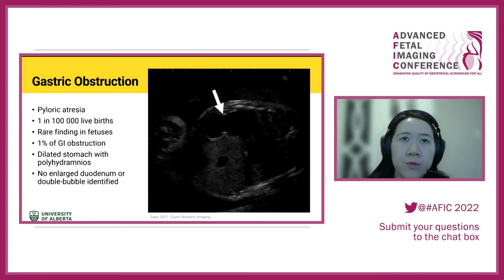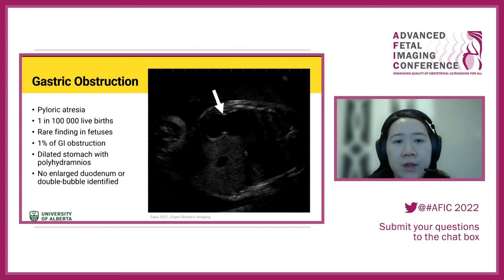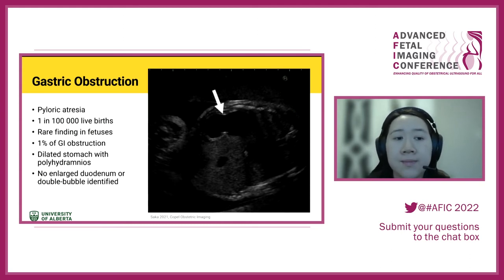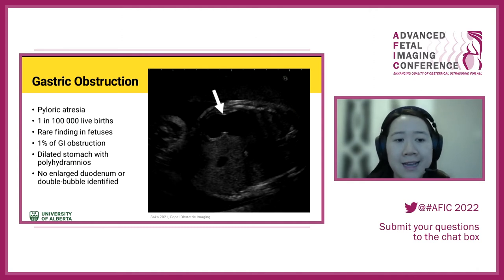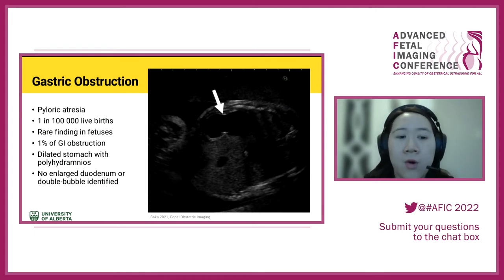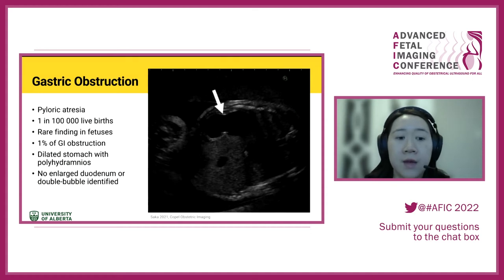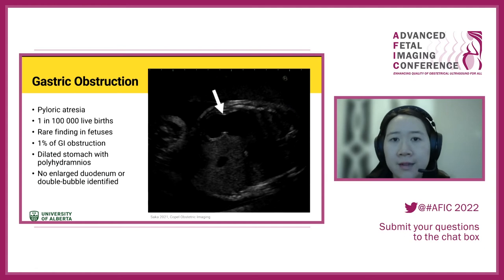For more rare findings: gastric obstruction, specifically pyloric atresia, is where the end of the stomach is not appropriately formed. This is a very rare finding — only about 1% of obstructions. You can have an isolated dilated stomach identified within the fetal abdomen with polyhydramnios, with no second bubble and no dilated duodenum.